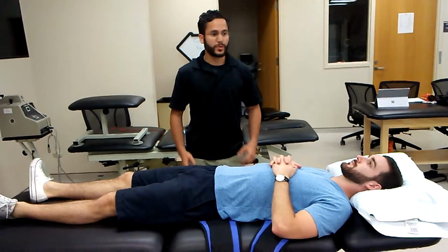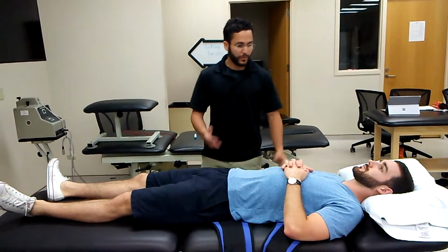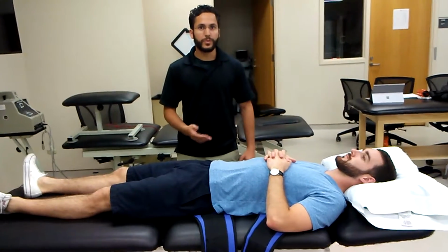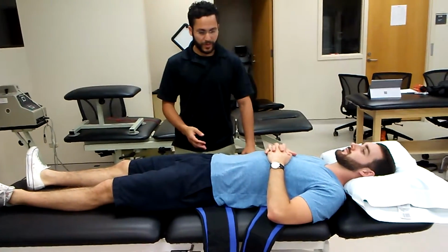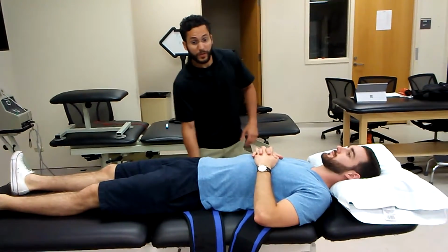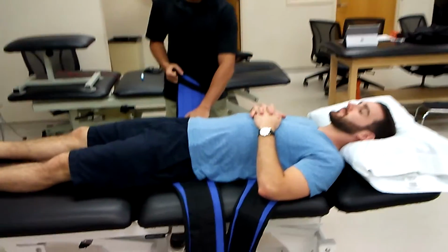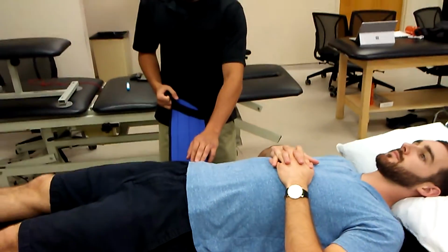And I'm going to show you the setup of lumbar traction. So here we have a patient who is a 25-year-old male that has lower back pain due to muscle spasms for the past few days. And right now we're going to set him up for traction. So first things first is making sure that the lower belt is in line with the iliac crest.